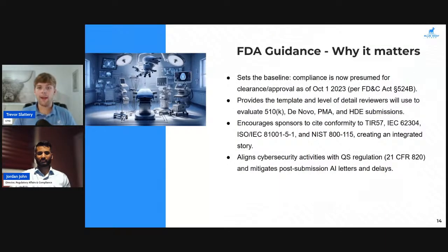Now, why it matters. So compliance is now presumed for clearance or approval as of October 1st in 2023. One thing that I will note here is actually as of last Friday, the FDA guidance was updated and finalized. But I believe it was September 27th when we had the previous finalization that then got completed within October. What the FDA was looking at then, that's when they're enforcing these cybersecurity requirements.